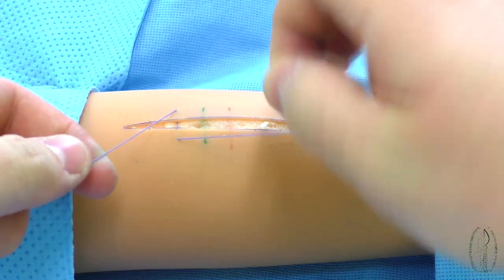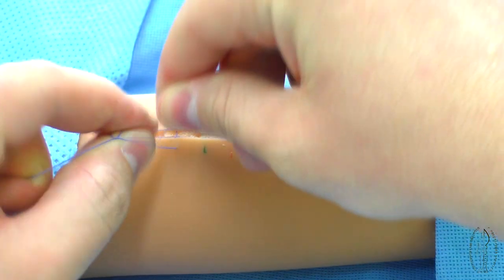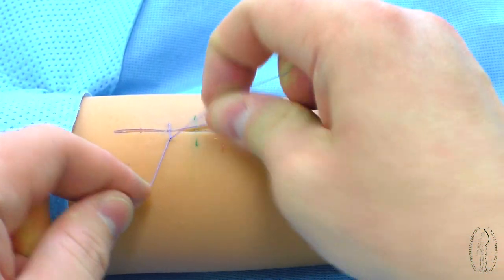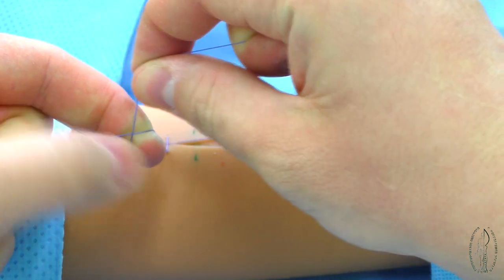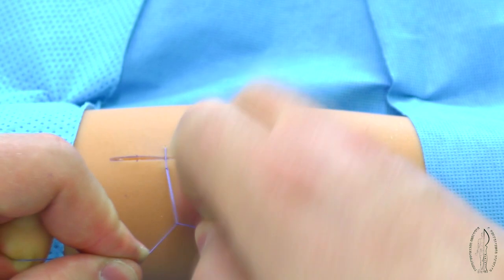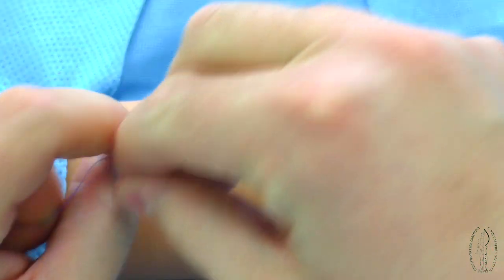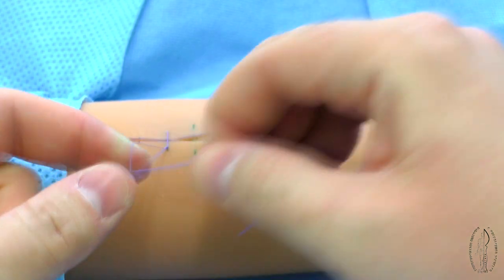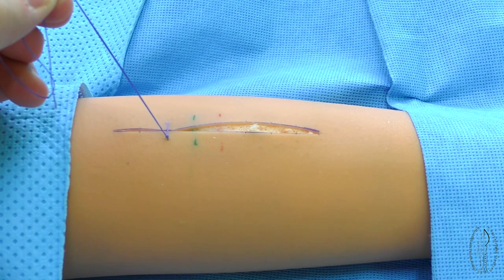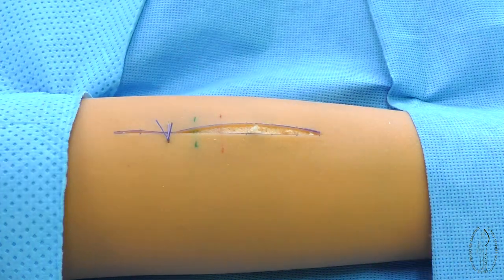The knot is made according to standard observance rules and the ends of the filaments are cut off. The points of needle input and output are located at an identical distance from the wound edges, approximately 5 mm. The distance between interrupted sutures is defined by the necessity of high-grade edge adaptation of the wound and averages 1 cm.